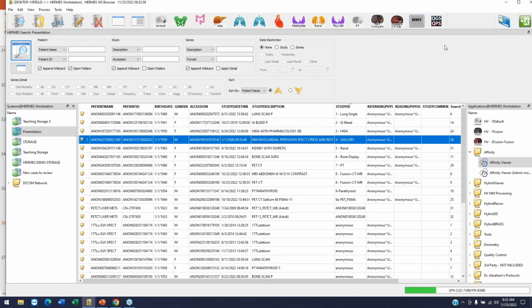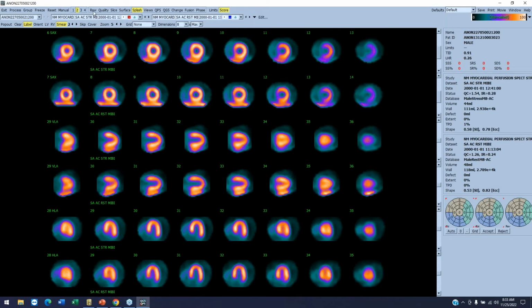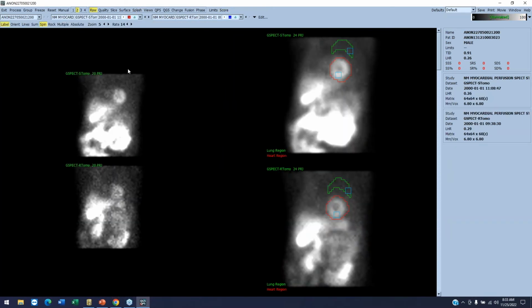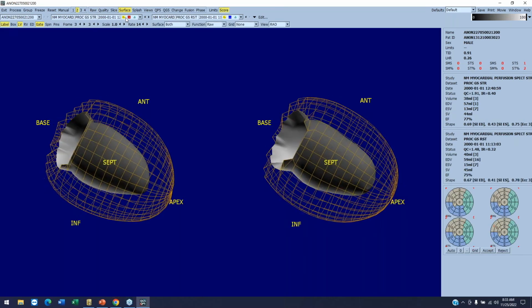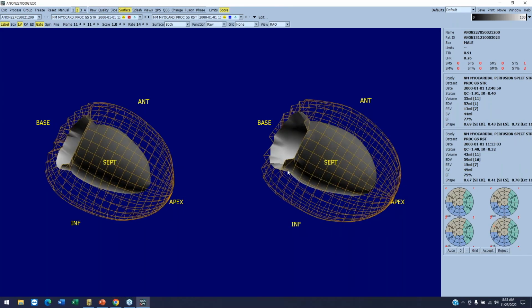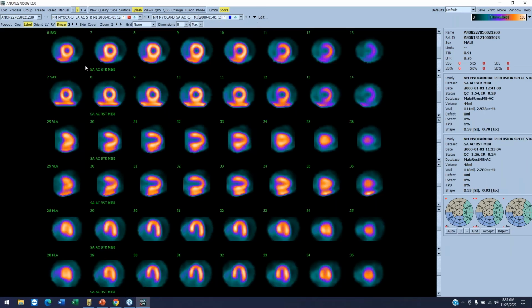Here's the cardiac study, which is launched from within Hermes, whether it be Cedars-Sinai or 4DM. Here's a patient with multiple comorbidities and dyspnea on exertion coming in for evaluation of myocardial ischemia. You can view the raw images. You can adjust the ROIs as needed. You can look at ejection fraction. In this case, it is excellent. And the splash screen to look at images on the short axis, vertical long axis, and horizontal long axis, and the study being a normal study.